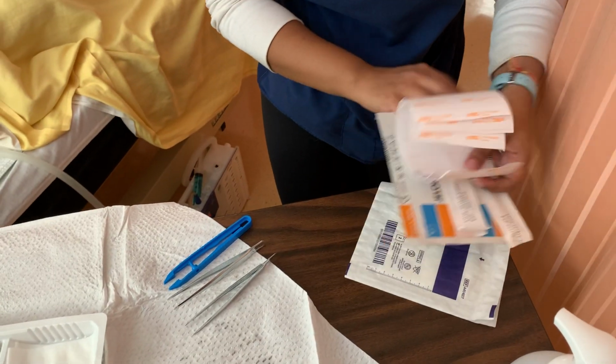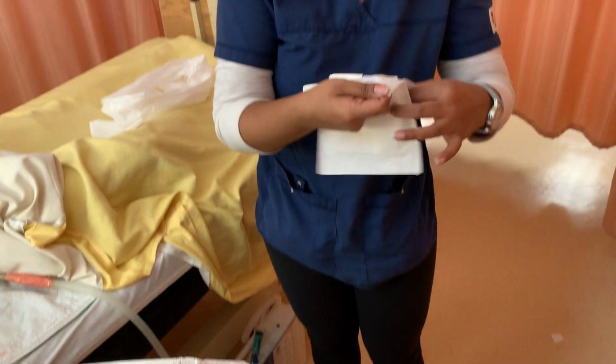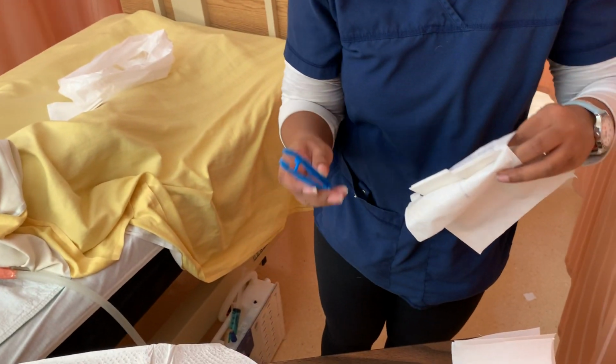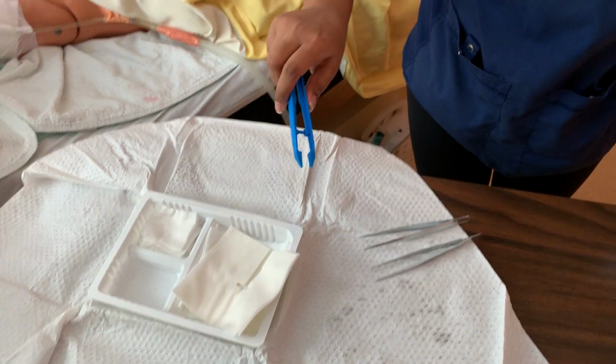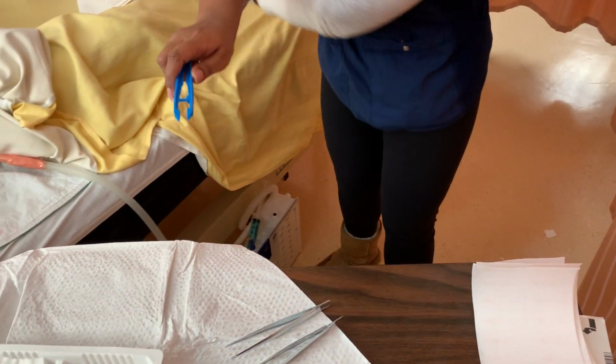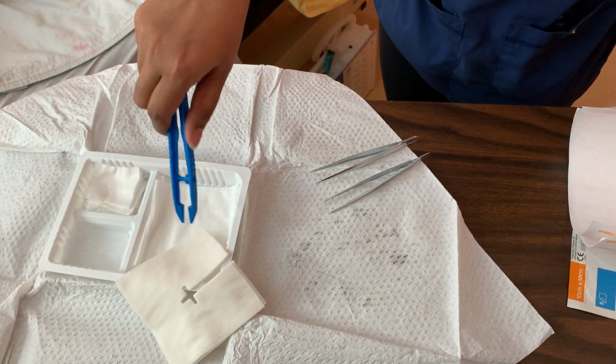I'm just going to wing this packaging back. Take out my IV drain sponge. Just throw that out. I can just move it a little bit here, still within my sterile border.